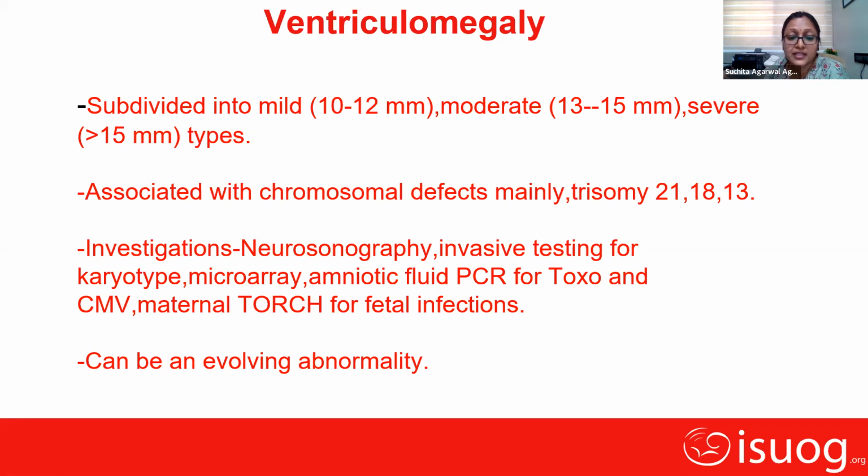What our mentors have taught us is to treat every scan as an anomaly scan. Whenever the patient comes to you, you have to see all the anatomy. Even in growth scans, we are supposed to see the anatomy of the patient, particularly heart, brain, everything. It doesn't take much time, just another 5 to 10 minutes extra to look over all those things.